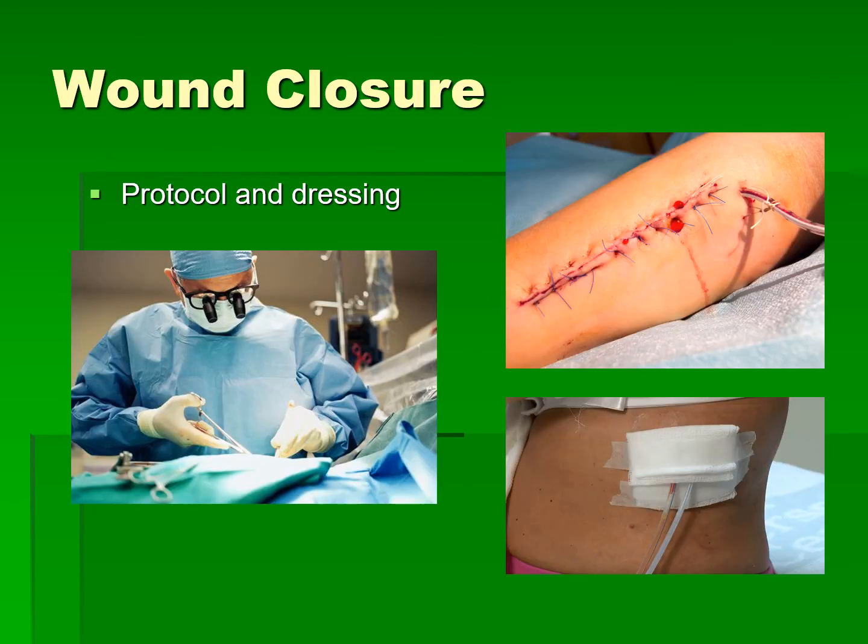All right, wound closure. When it gets time to close the wound, when we pass that closing stitch, that's when we would want to initiate our closing count. Whenever you pass a stitch loaded on a needle holder, you're also going to pass a forceps, and then you're going to anticipate needing to cut that suture. Those three things pretty much always go together.